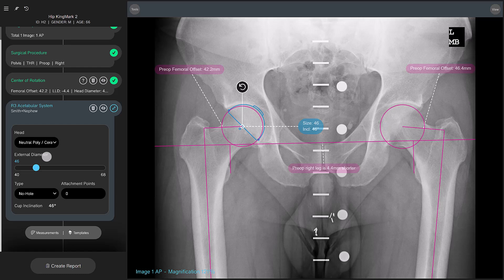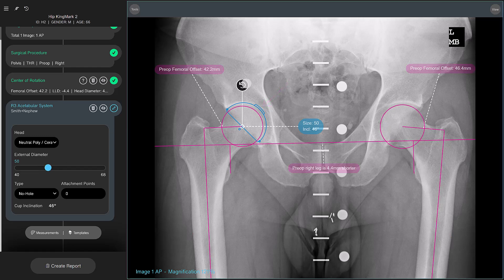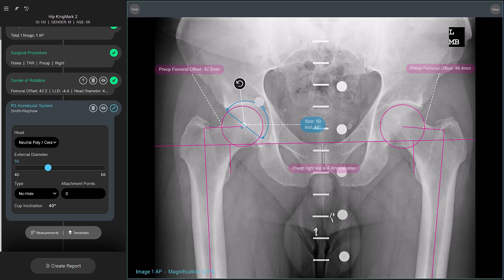Let's say the cup seems too small. You can increase the size by dragging the external diameter slider to 50, for example. Notice how the appearance of the cup changes on the image. You can also change the inclination angle from 46 degrees to 40 degrees. Let's try moving the cup to a more realistic position.